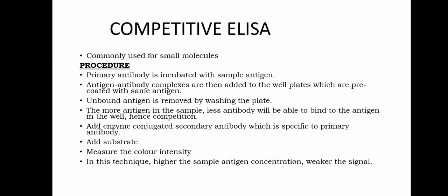The next one is competitive ELISA. This technique is mainly used for small molecules. Here, the antibody is first incubated with a sample antigen, and these antigen antibody complexes are then added to the well plate which contains the same antigen. Unbound antigen is removed by washing the plate.